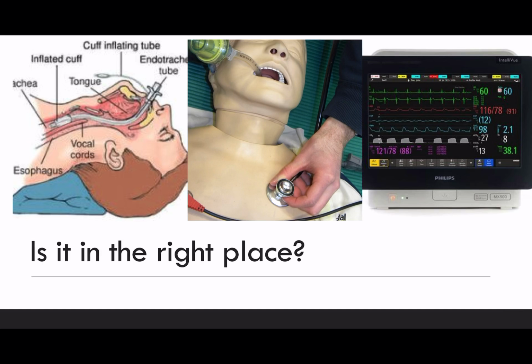Commonly, it goes into the right main bronchus. Just anatomically, the way it sits, it's just more likely for it to follow that route. Now, by getting what we call an endobronchial intubation, you can collapse down the other side of the lung, which is not getting gas, and therefore these patients can very rapidly desaturate.